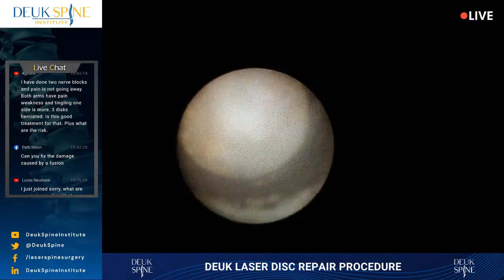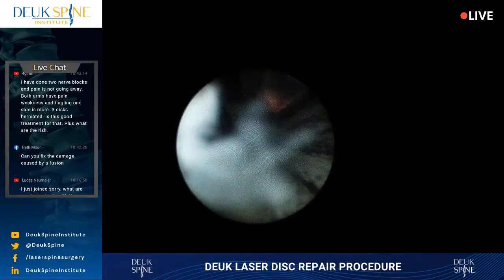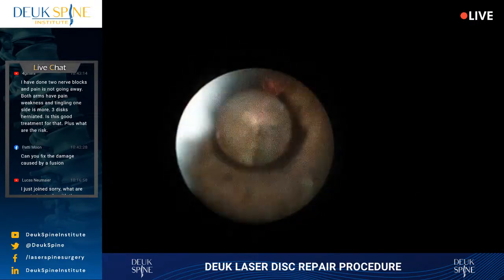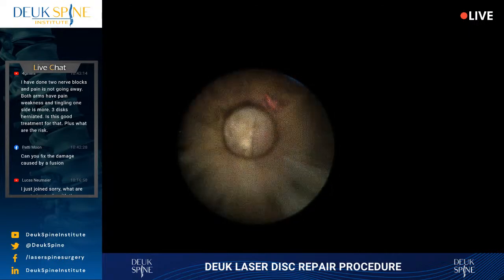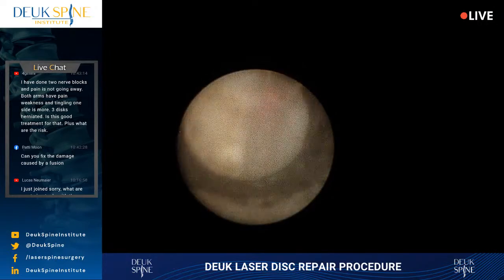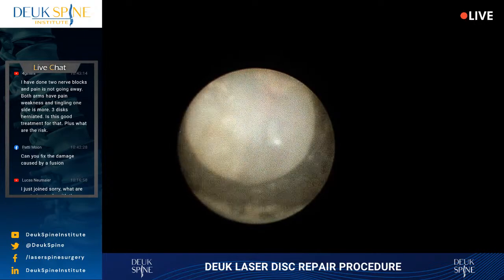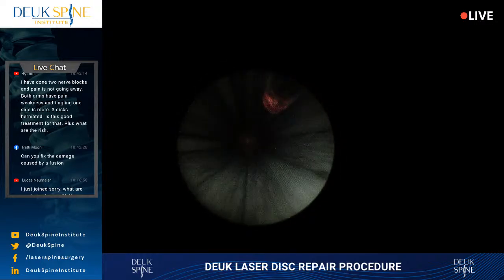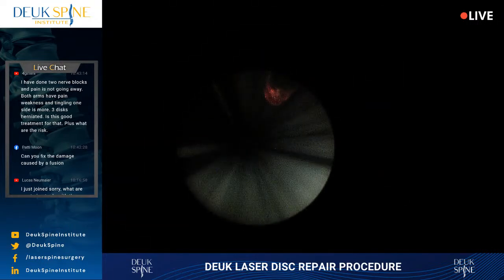It comes in many forms. You choose your imaginary scenario, but the point is the surgeon didn't fix all the discs that needed to be fixed. Now this guy right here we're fixing, he's got 4 damaged discs, but I think 3 of them are causing 99% of his symptoms. So we're fixing 3, not all 4. But that's because I have many years of experience doing this, and I'm really good now at figuring out which discs cause symptoms and which don't. Make sense? So if I wasn't 100% sure, I would do what's called a discogram to figure it out.